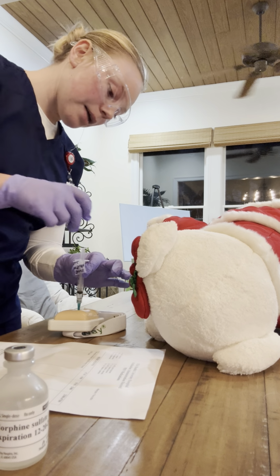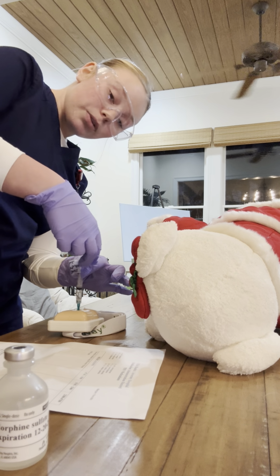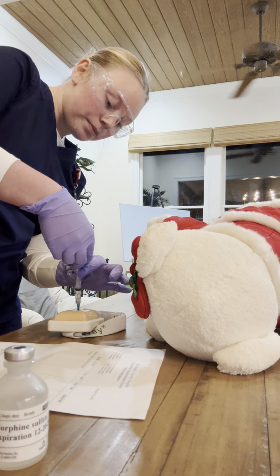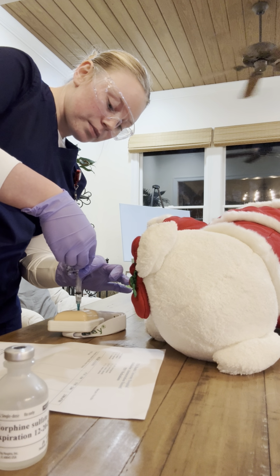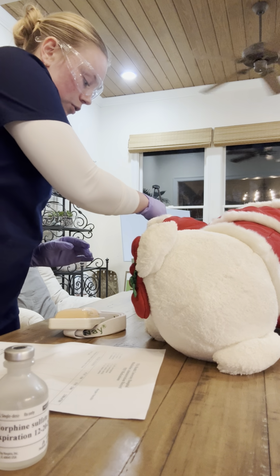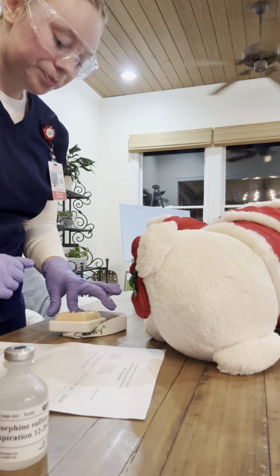All right, I'm going to aspirate. All right, I don't see any blood, which means I can continue to inject very slowly. I'm going to pull straight out, go right into my sharps container, and I'm going to apply firm, gentle pressure.